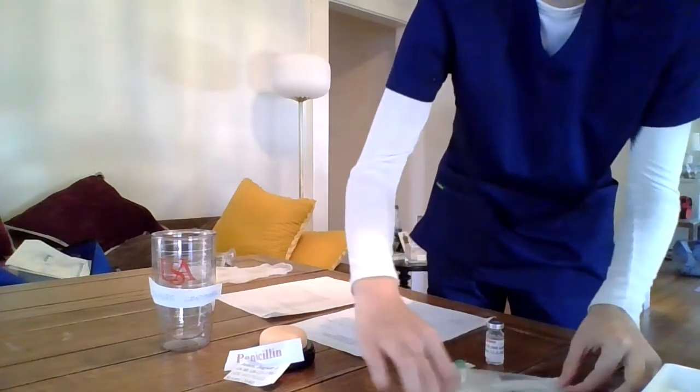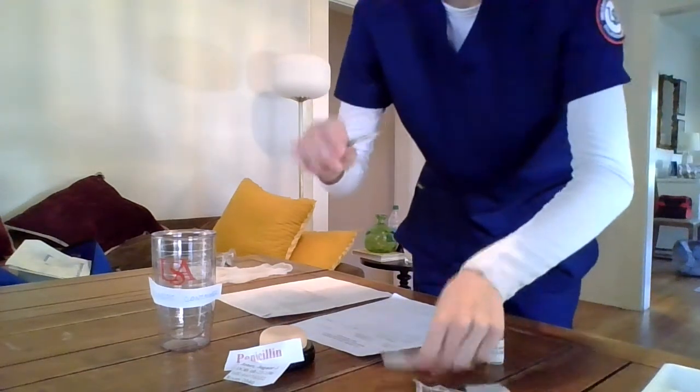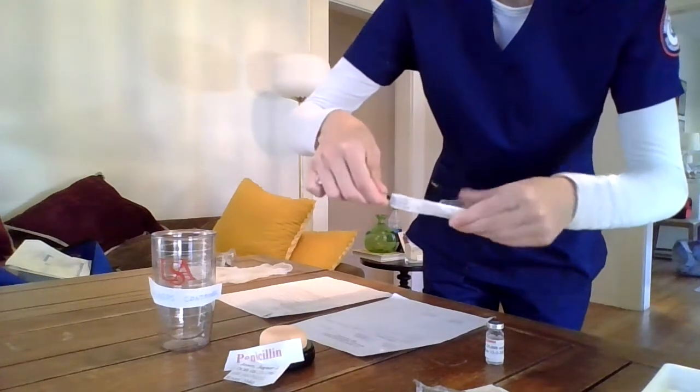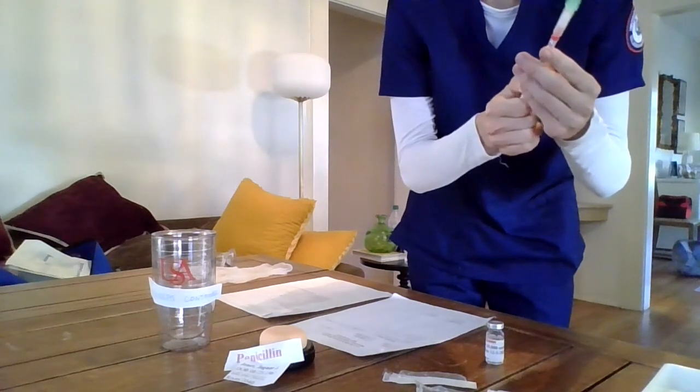Then I'm going to grab my syringe and we'll remove the cap from that and attach it to my needle assist. Okay, so then I'm going to pull back about half a milliliter of air.